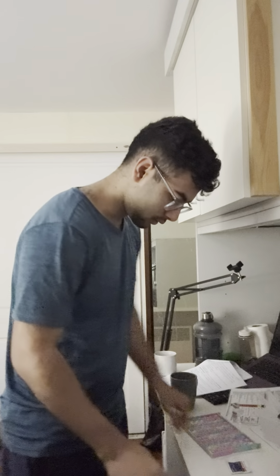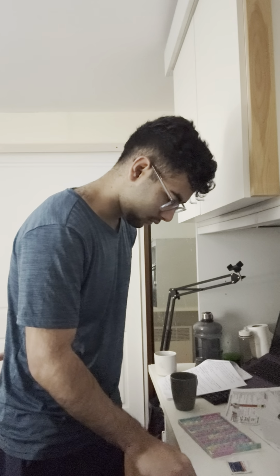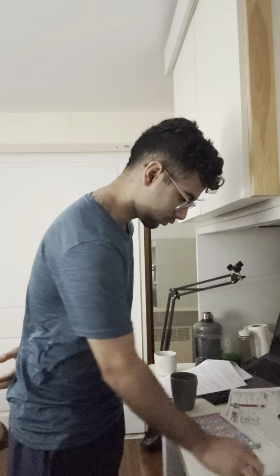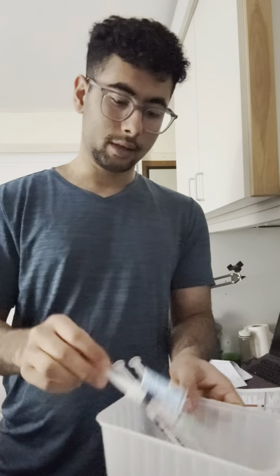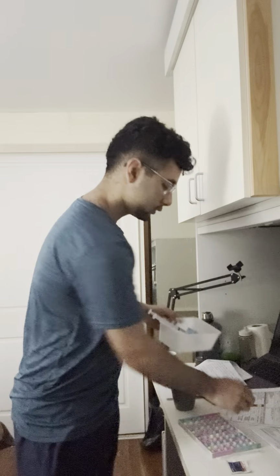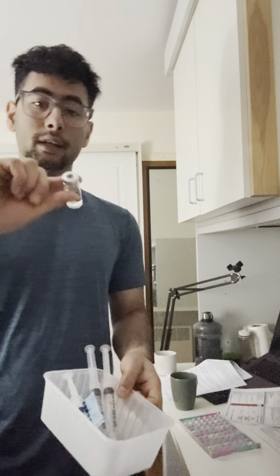As I said usually, don't use your hand to prick, otherwise you might prick yourself. Use this, do like this. Oops. Cool. Now this is ready. So what we got? We got the antibiotics, we got 2 saline for post and pre, right? So we got 3 items, and you're going to put this medication here as well. So we did everything in front of the nurse. The nurse is happy. She had a look. So just grab yourself an alcohol swab as well to clean it. And before breaking this, you always make sure to clean the top of the vial using an alcohol swab as well.